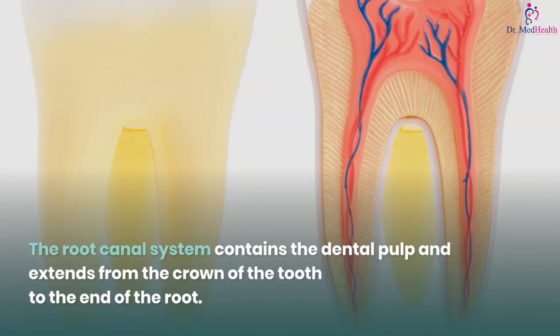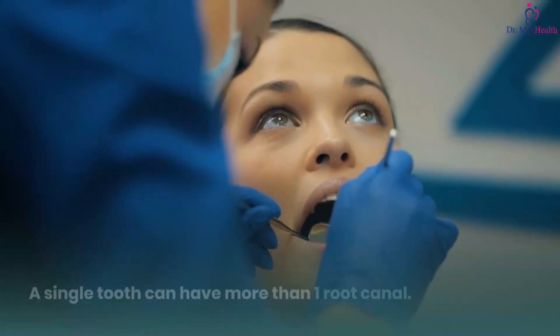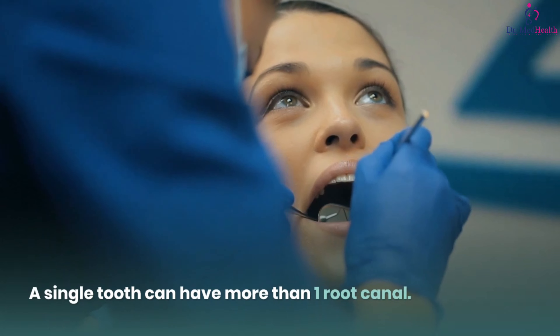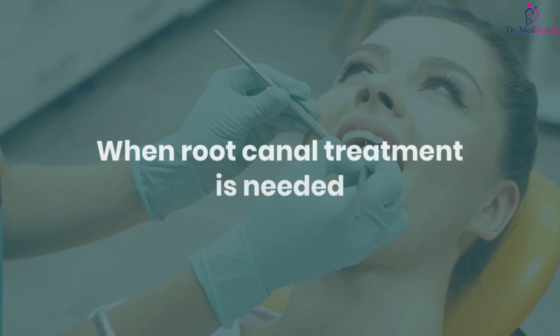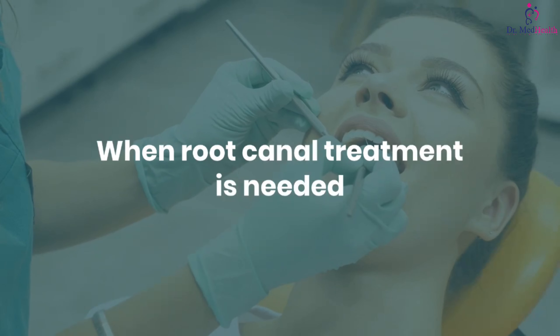The root canal system contains the dental pulp and extends from the crown of the tooth to the end of the root. A single tooth can have more than one root canal.